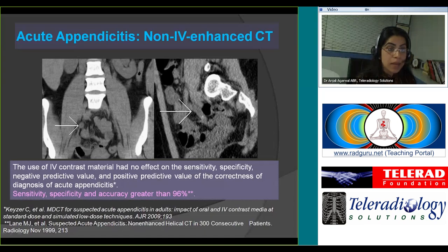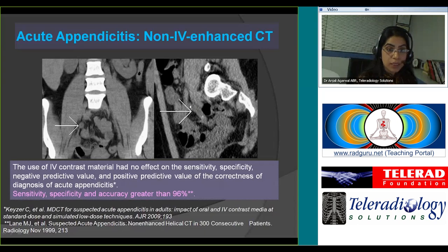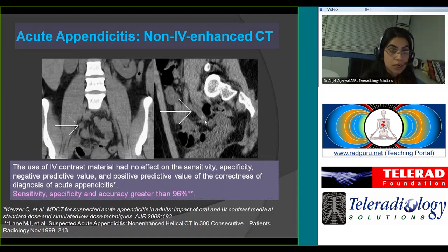These are examples of appendicitis diagnosed on CT urograms — non-contrast CTs. This particular thickened appendix shows some dirty fat around it. On the sagittal reformatted images, you can again see a thickened appendix with an appendicolith, suggesting acute appendicitis.